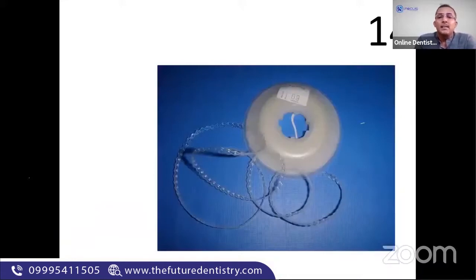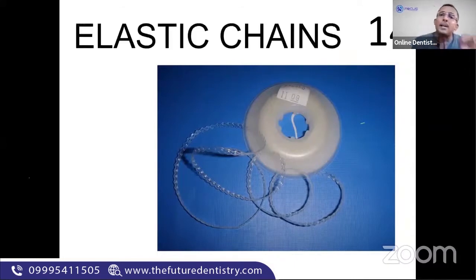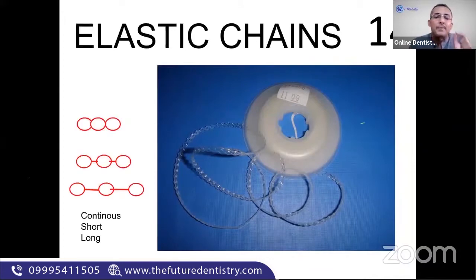Question number 14. Anybody wants to guess on this? What is this? Identify this can be a question. It was a question many years before. Recently, I haven't seen. E-chain. Perfect. So that's called elastic chain or E-chain. Now, if they want to confuse you, they can talk about E-chain has something called as continuous, short, and long type of. There are 3 types of E-chain.